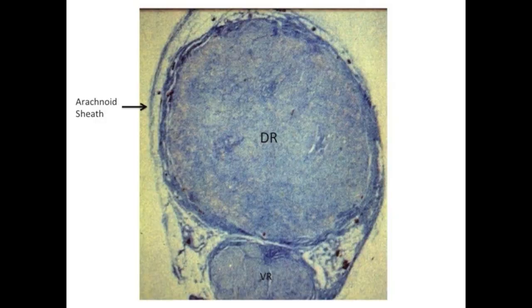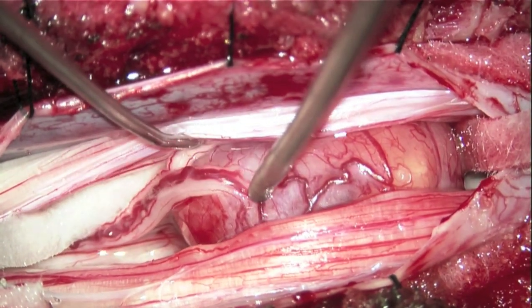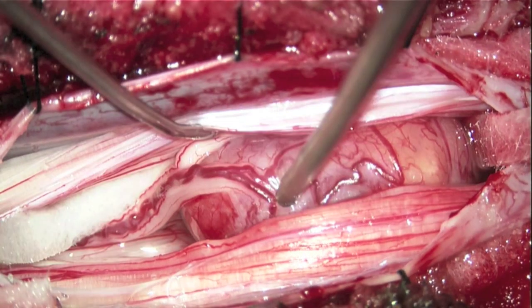It is important to recognize that each segmental dorsal and ventral root share a common arachnoid sheath, as shown in this cross-section of an intradural nerve root. Further dissection now reveals the right L4 ventral root tightly applied to the tumor capsule. In this case, the right L4 dorsal root is the nerve root of origin of the tumor, and the right L4 ventral root is referred to as the corresponding nerve root.